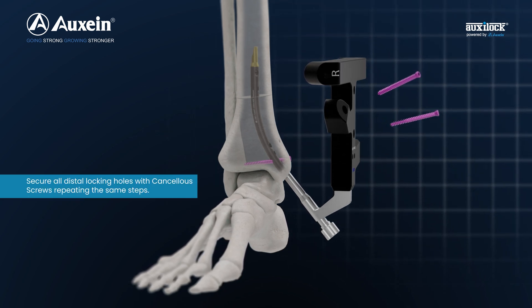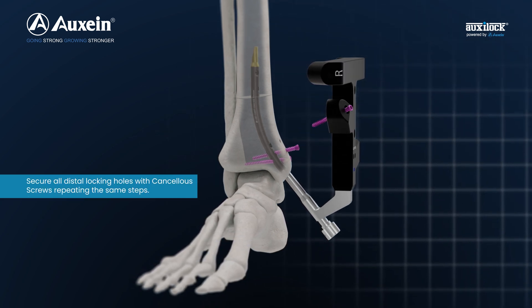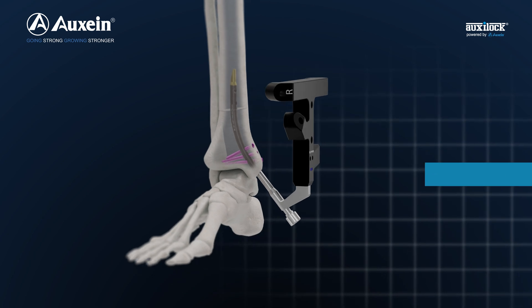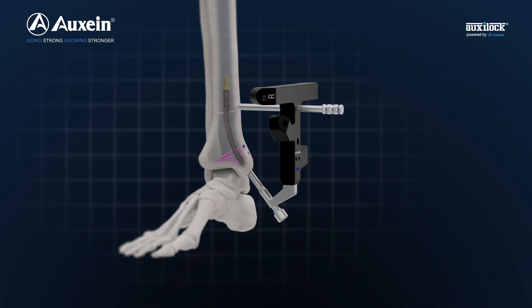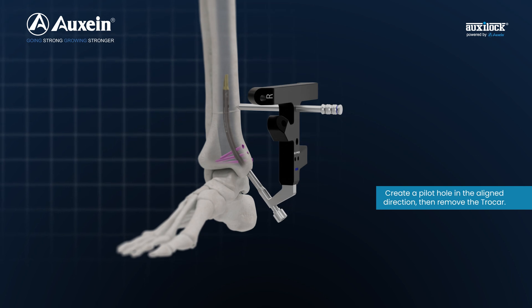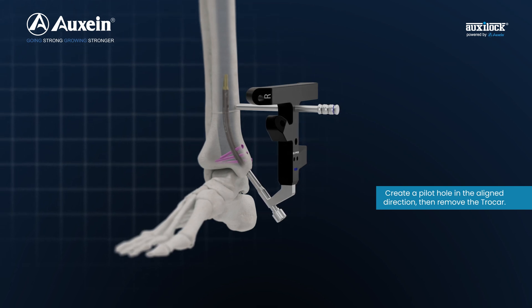Secure all distal locking holes with locking screws repeating the same steps. Insert the trocar assembly into the proximal hole of the jig. Create a pilot hole in the aligned direction, then remove the trocar.